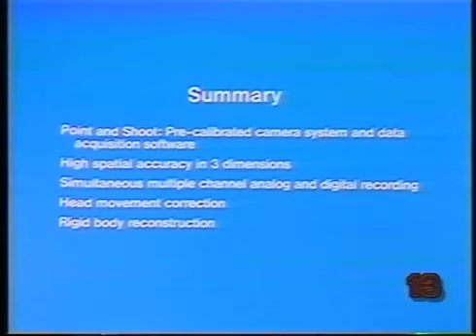The ability to track many markers and calculate coordinate transforms makes head movement correction possible, as well as complex rigid body reconstructions. These features are particularly useful in situations where subject mobility is not easily controlled.